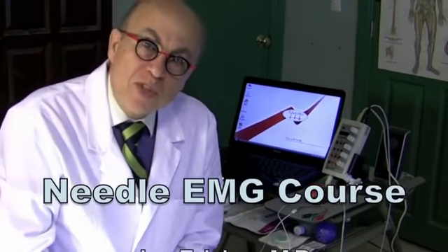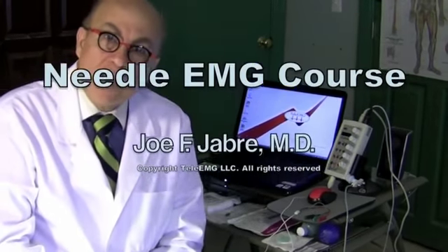Hi, I'm Dr. Joe Jabre. I'm a neurologist and I specialize in EMG. EMG stands for electromyography, which loosely translated means electrical testing of nerves and muscles.